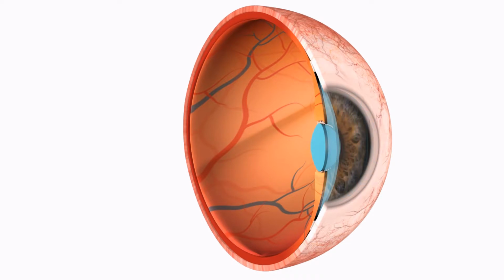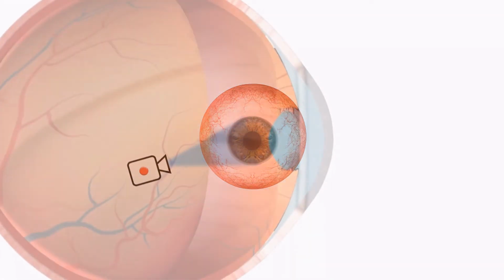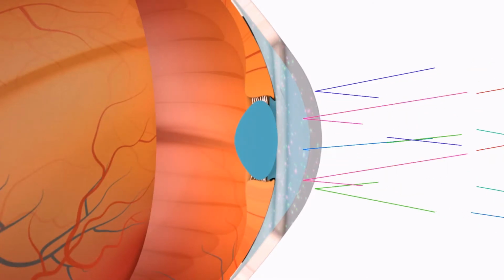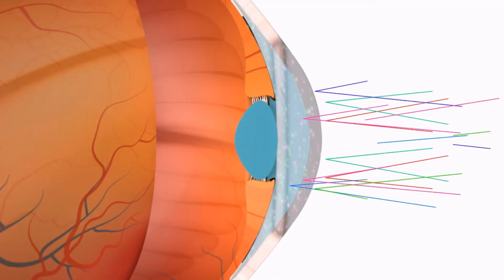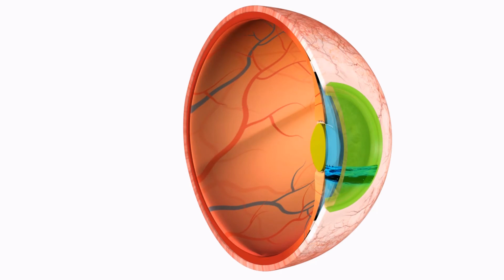Various methods are used worldwide. Scheimpflug imaging is widely used, especially in refractive surgery, but there are concerns about repeatability, and these images are rarely incorporated into cataract surgery calculations. Ray tracing and assessment of second Purkinje images is one newer technique currently available, and the incorporation of swept source OCT into biometry devices appears to be the latest method of assessing total corneal astigmatism. So many different techniques attempting to measure one thing indicates that none of them are perfect.